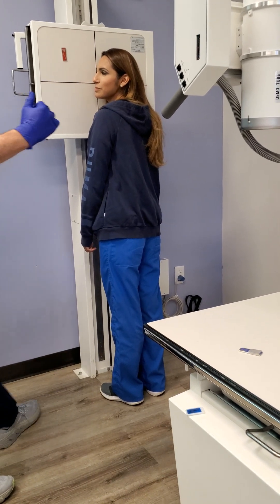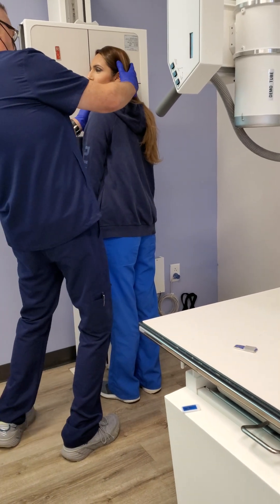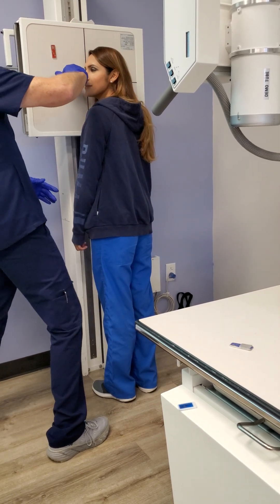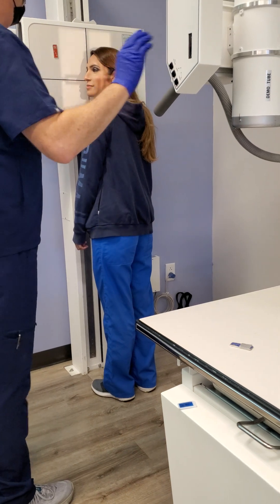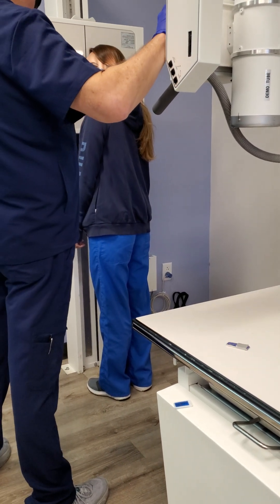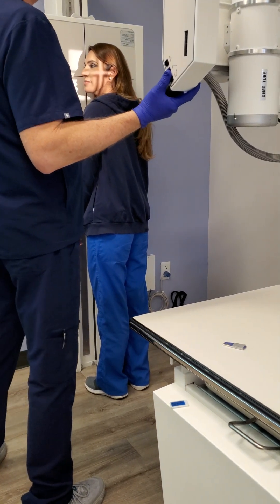Which positioning line do we use to make sure there's no tilt? IPL. IPL needs to be how? Perpendicular to the IR. This line right here. SID should be 40, correct.